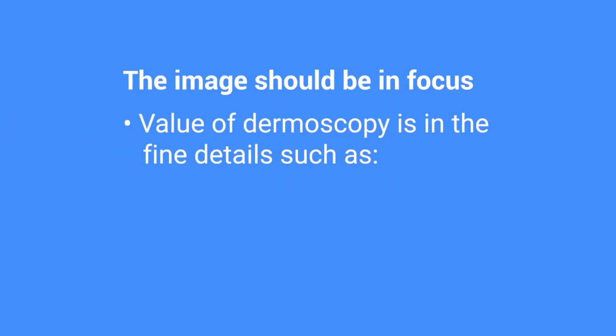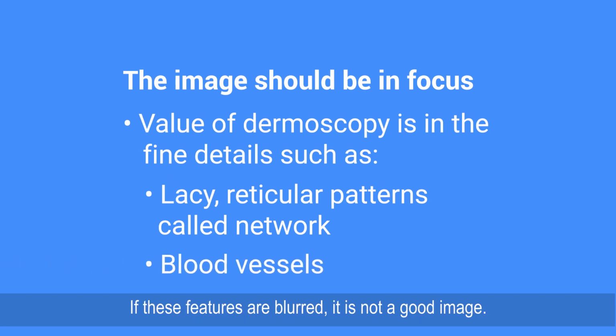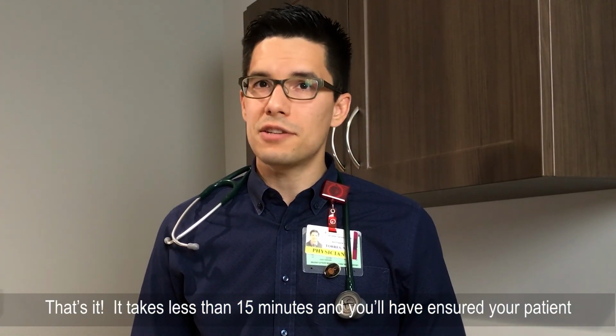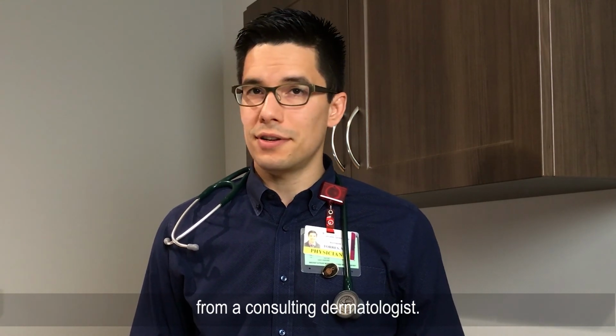The image should be in focus. The value of dermoscopy is in the fine details we can see with the magnified image, such as lacy reticular patterns called network and blood vessels. If these features are blurred, it is not a good image. That's it. It takes less than 15 minutes, and you'll have ensured your patient receives an accurate diagnosis and gets expedited care from a consulting dermatologist.